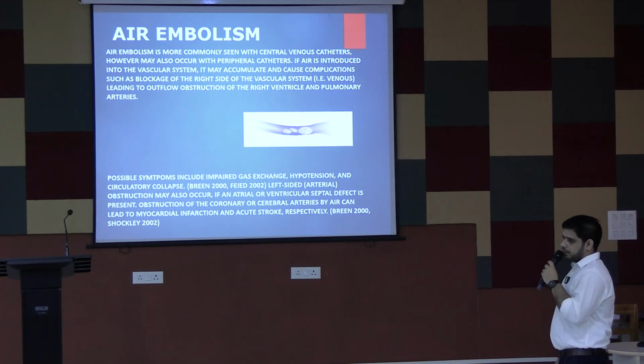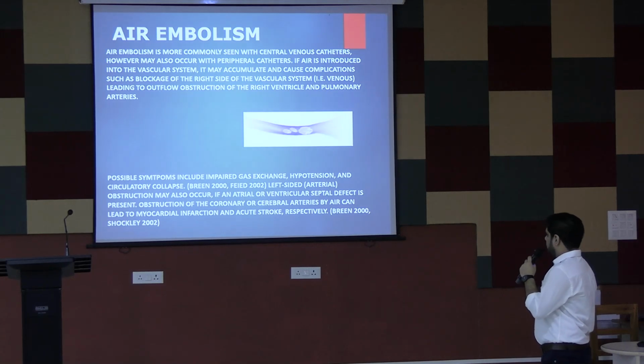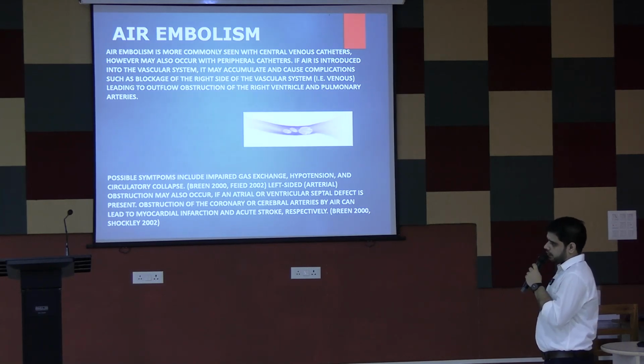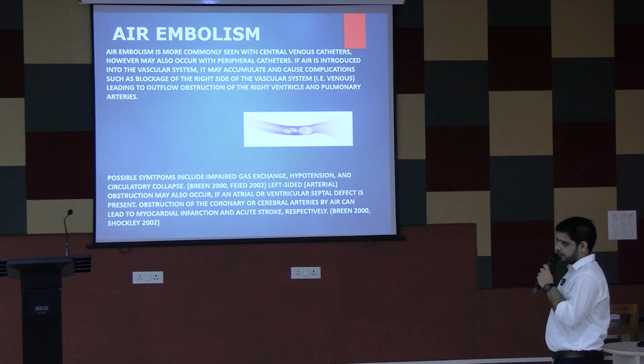Air embolism. During the introduction of the IV cannula, there is often a chance that air can be passed into the vein from the saline bottle or IV set, and then air embolism can happen.